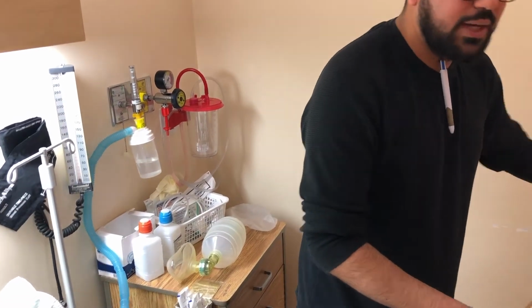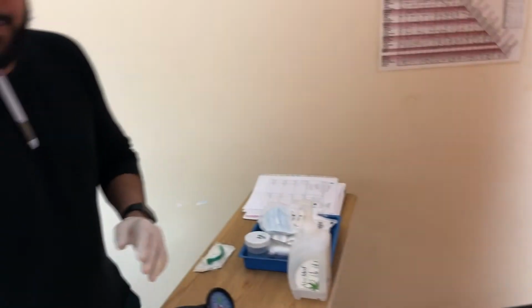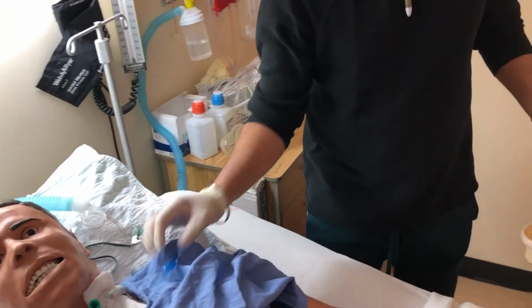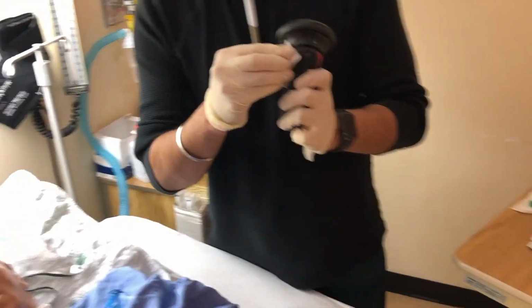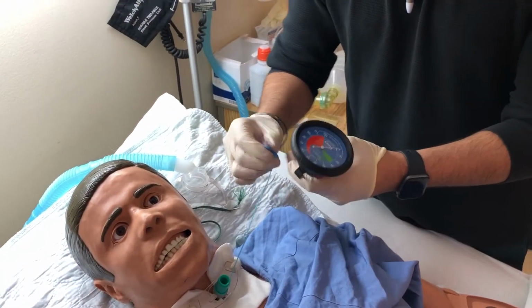First alcohol swab. I have alcohol swabs right there if you want to grab those. Thank you. So we want to alcohol swab both this and this. This is already sterile because it's closed, so we want to alcohol swab this guy right here. This portion right here. And we can open this guy up and attach that right there.